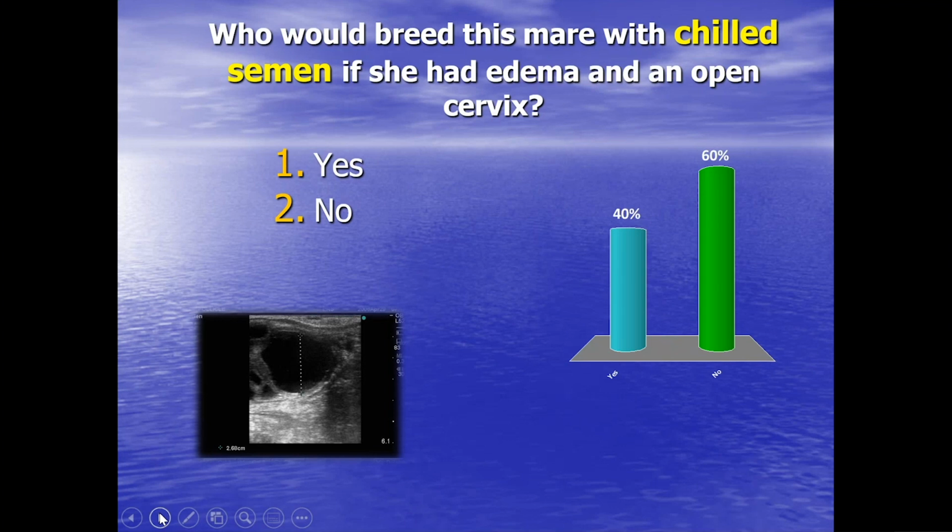We're just going to have to see what this follicle does, because I just don't know whether it's going to hang on or not. It's a little bit unusual. It's a small follicle with some shape changes. So I think, well, I'll sit tight before ordering. But if it was late in the season, I'd discuss it with the mare owner. Especially our well-educated owners, who are always the best ones, and by that I don't mean general education, I mean those who know quite a lot about mare gynecology, I would show them on this. I would say, look, we've got this kind of conflict here.